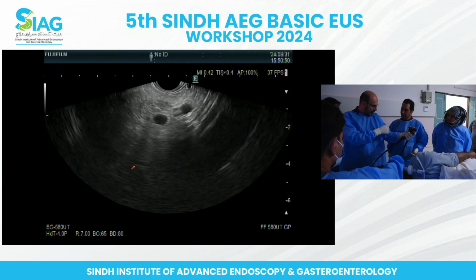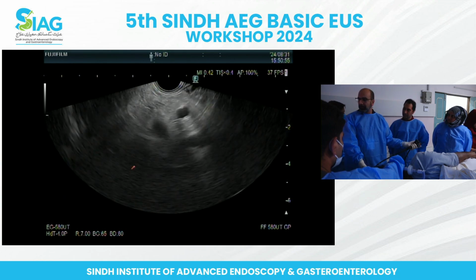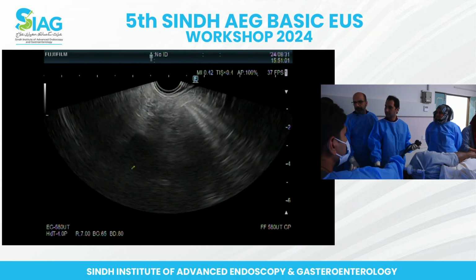This is not very bent. The tendency early on is to do this. So just keep this straight and just do this. And then we'll have to go to the bulb so you get to do more than one station.